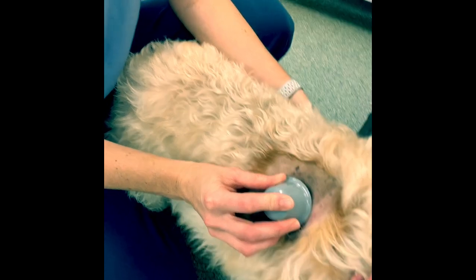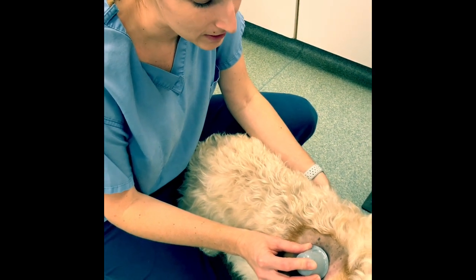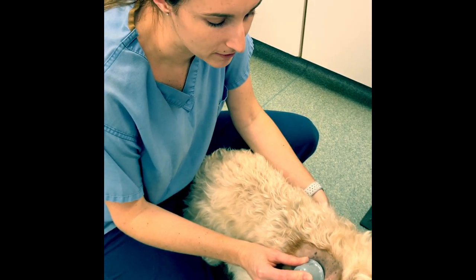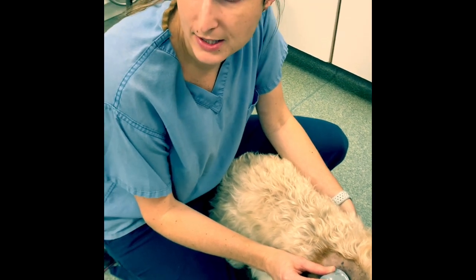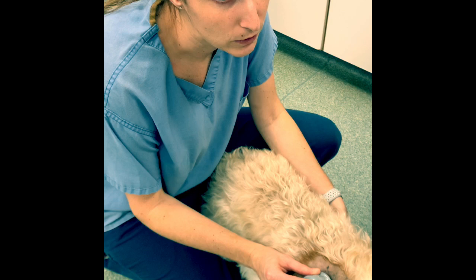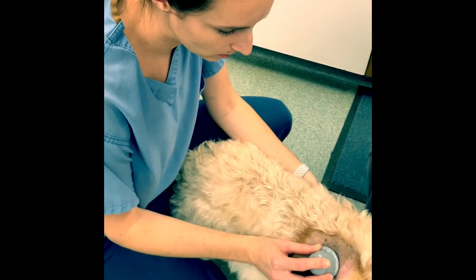We've watched some other videos of people doing this because this is our first time, and they did say that sometimes the sensor doesn't want to come out of the applicator properly, so you might need to use a hemostat. We have our hemostat on the ready, but we'll leave this sit here for just another ten seconds or so to make sure everything looks good.